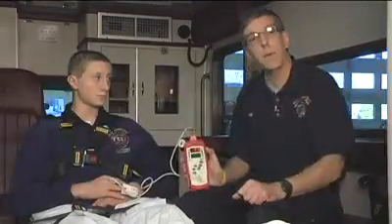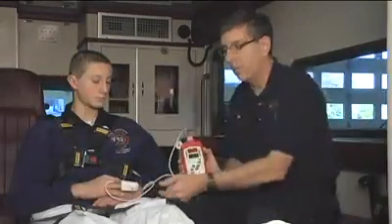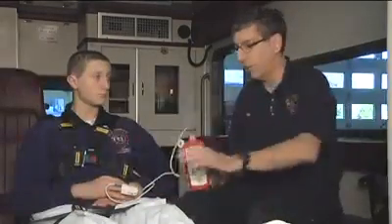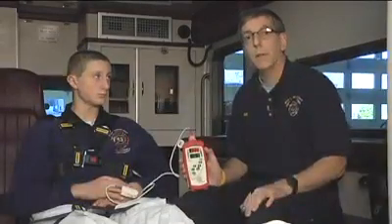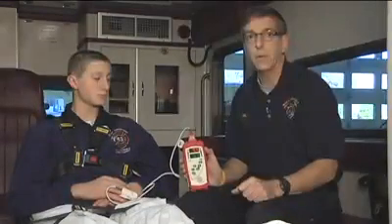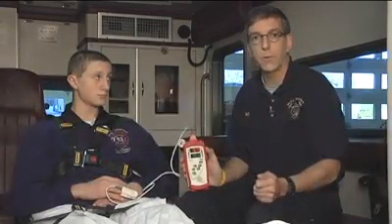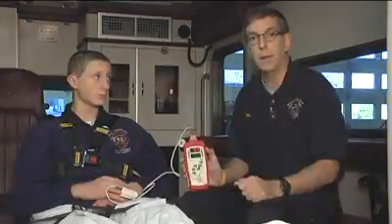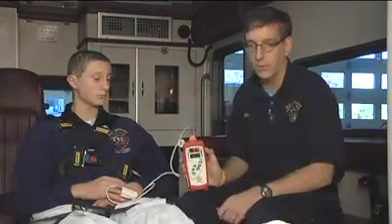Another question is ambient light. Certain forms of ambient light can interfere with the pulse oximetry signal. Sunlight is one — very bright sunlight may require you to put a towel over the extremity with the probe. Indoor lights such as fluorescent light in the back of your ambulance or rescue, or xenon light in a sports stadium, could also interfere. Putting a towel over the extremity will eliminate that interference from the readings.